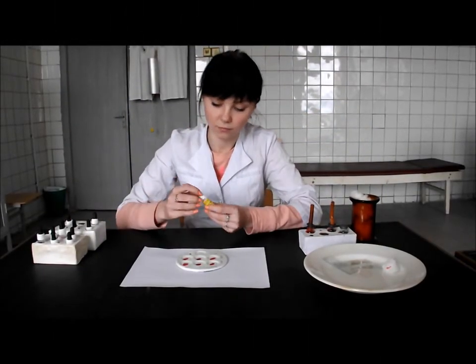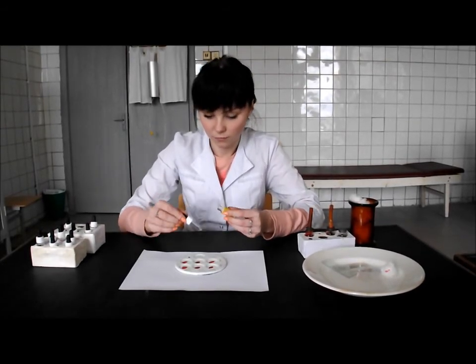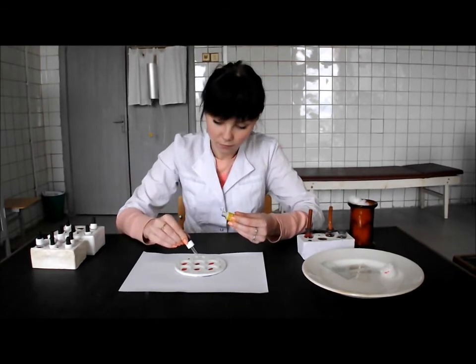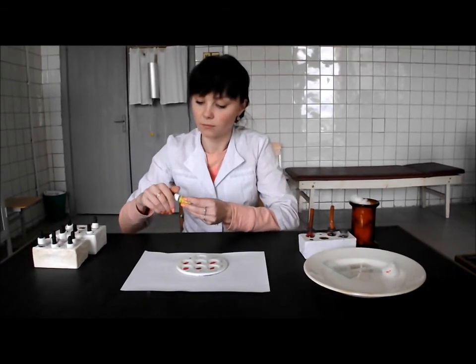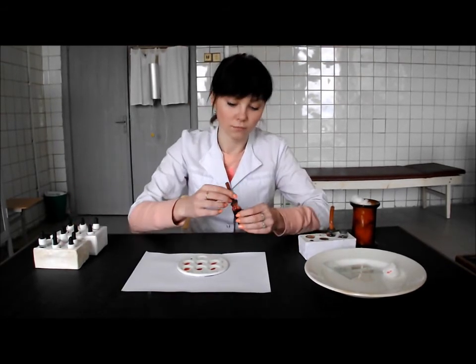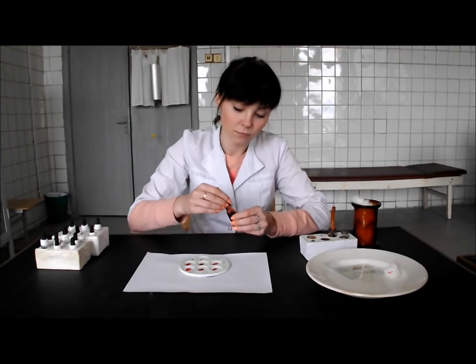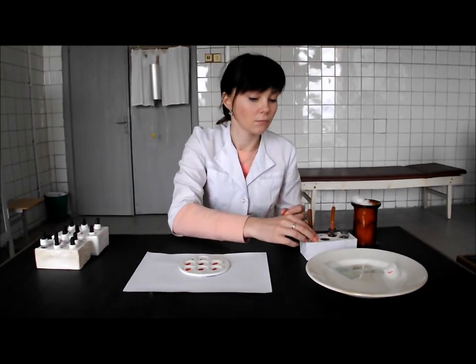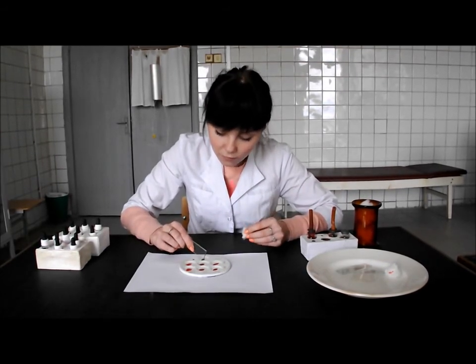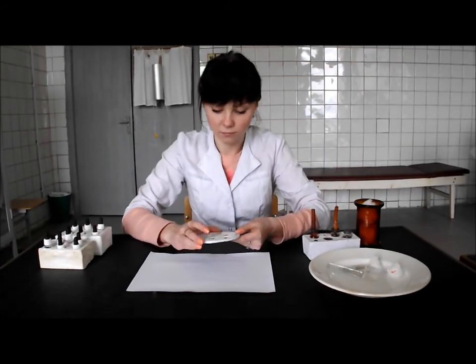When the result is positive in all the cells, the research of sample blood with the standard serum of the fourth blood group is held. Put the drop of this serum into the seventh cell of the dish and a small drop of the blood near it. Mix the drops.